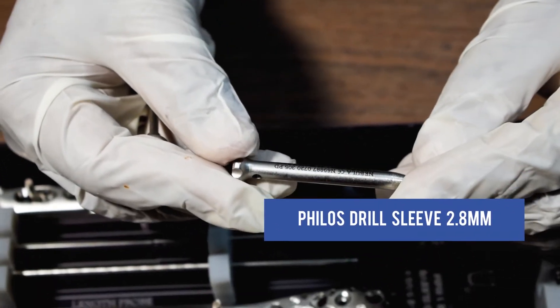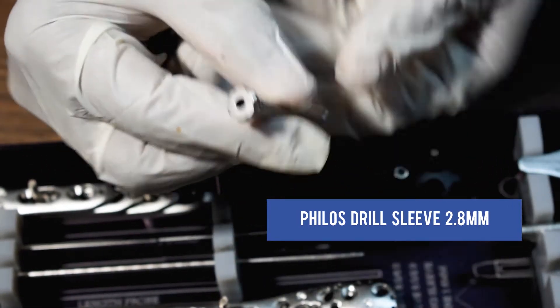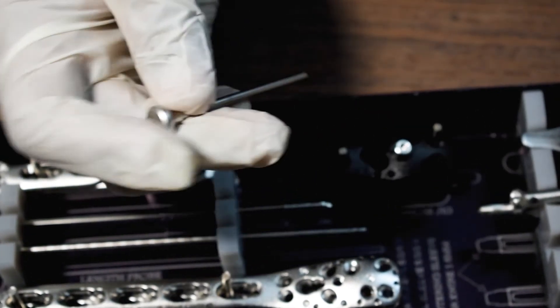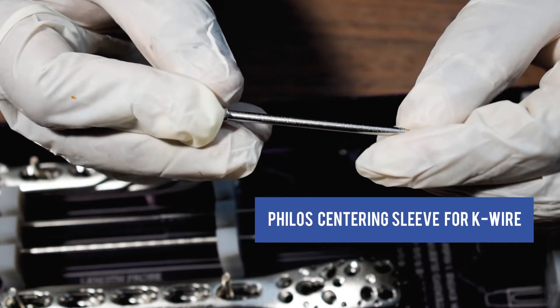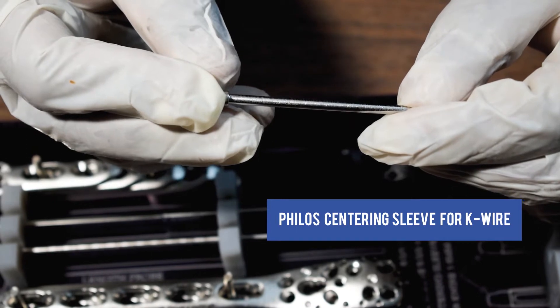This is the Phyllos Drill Sleeve for 2.8mm. This is the Phyllos Centering Sleeve for Keyware 1.5mm.